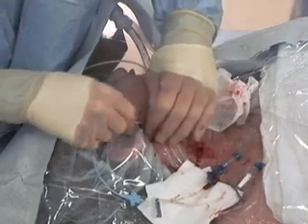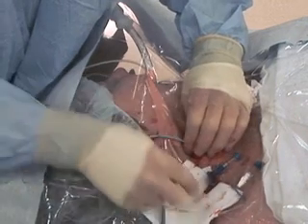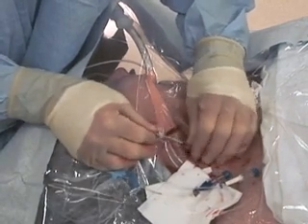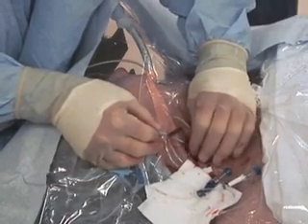Now, feed the catheter over the guide wire, being certain to maintain control of the external end of the wire before advancing the catheter through the skin. This usually requires that the wire be pulled slightly out of the patient until the external end of the wire extends out of the catheter hub and can be grasped.